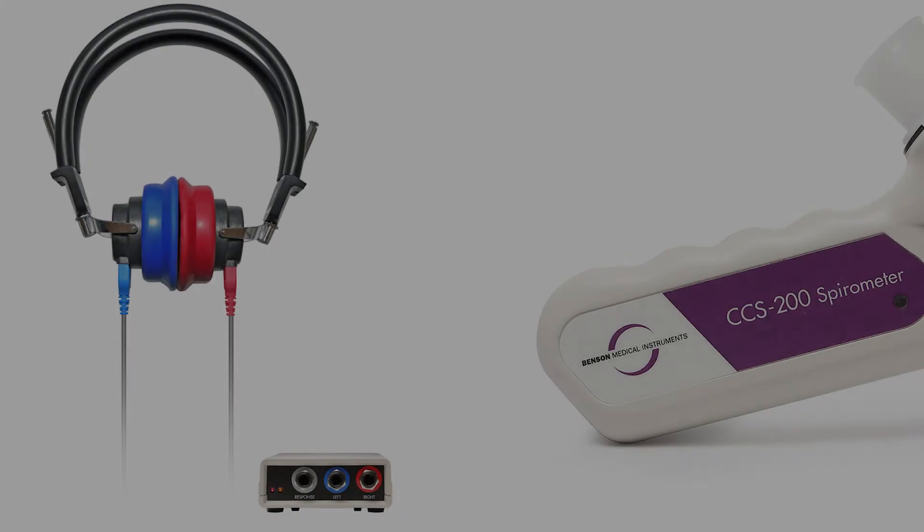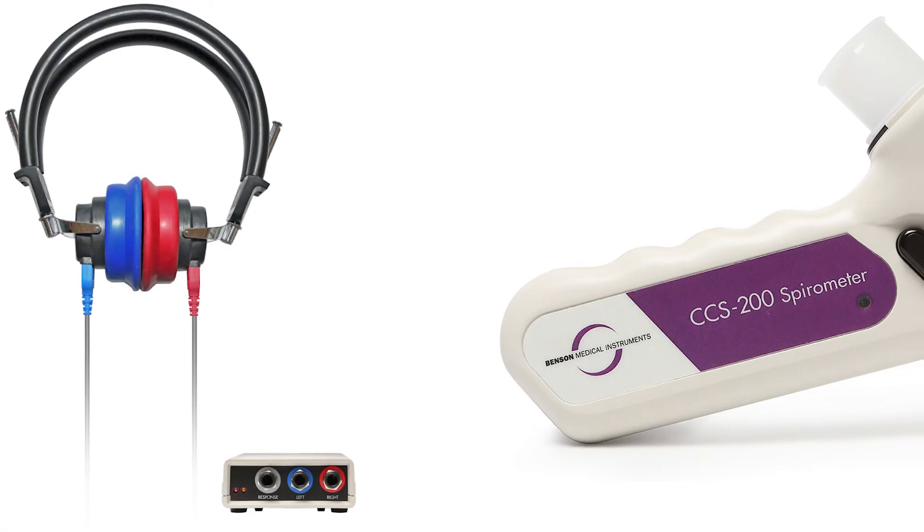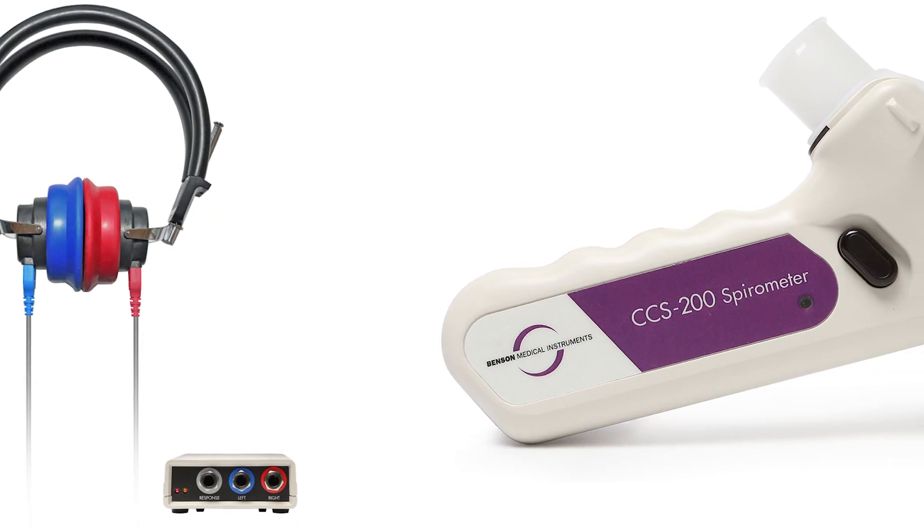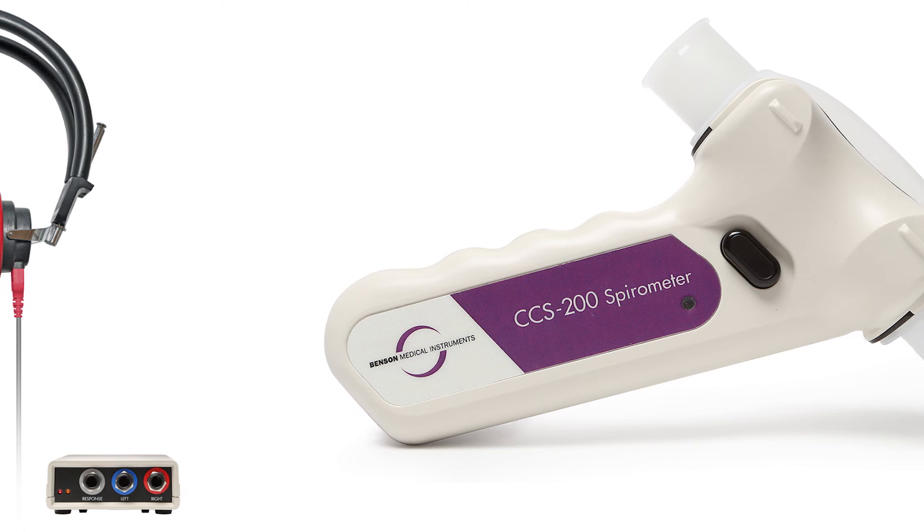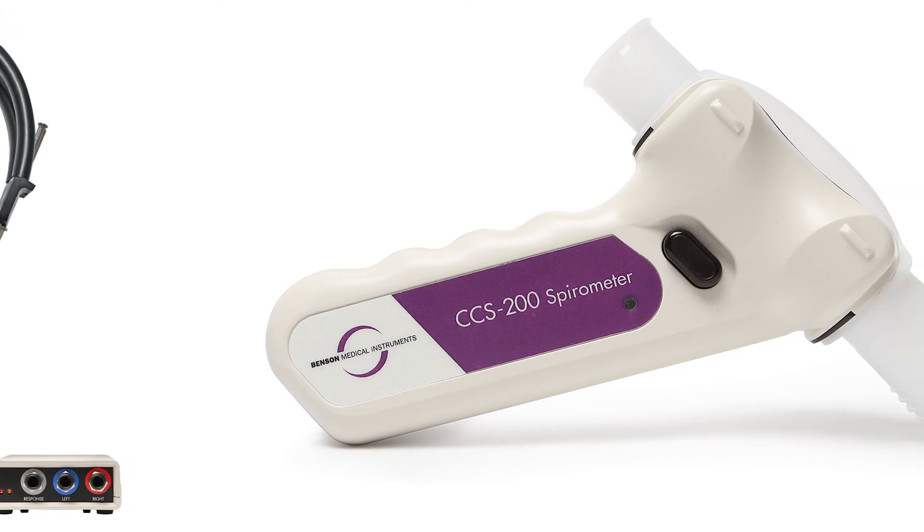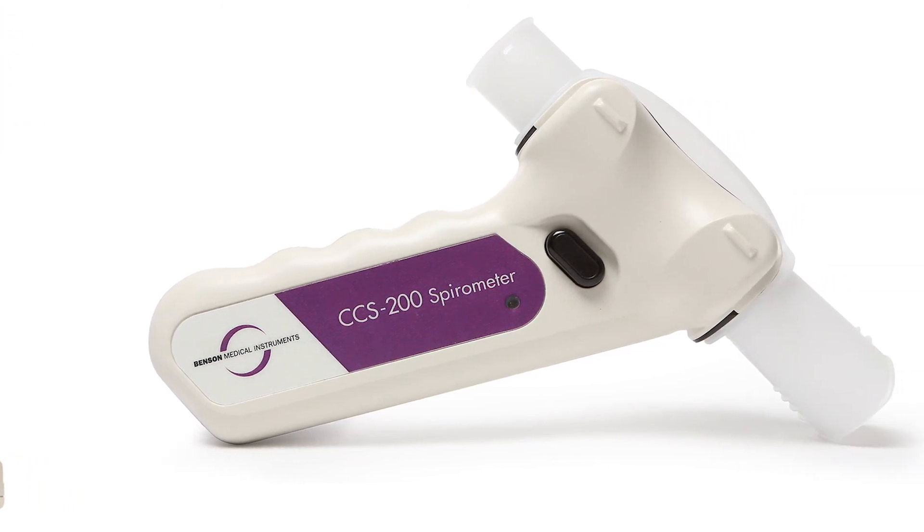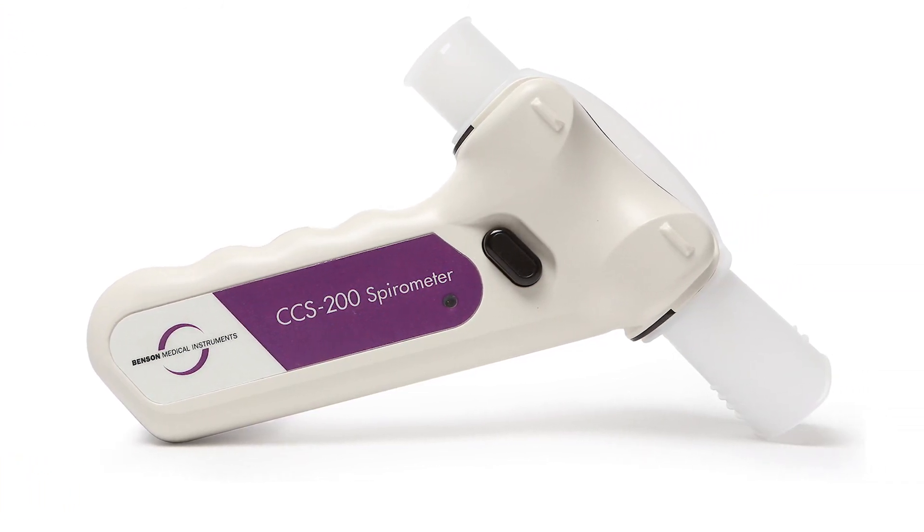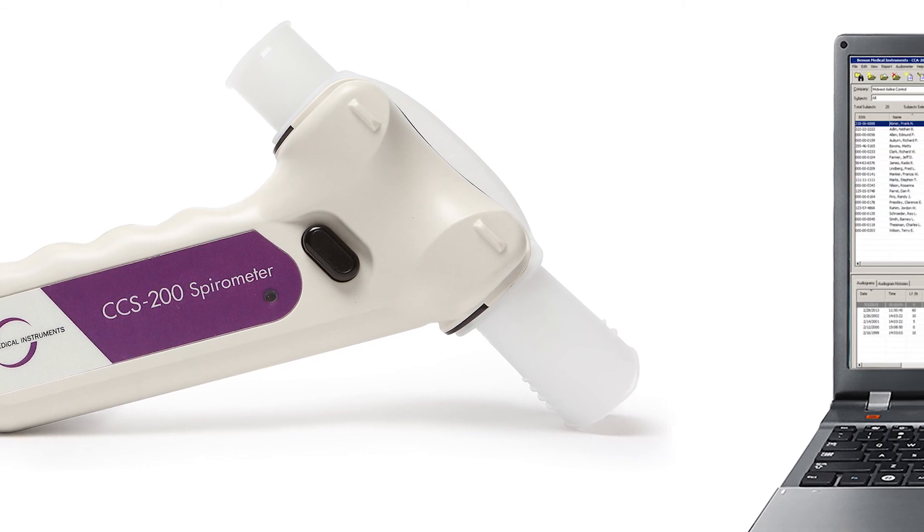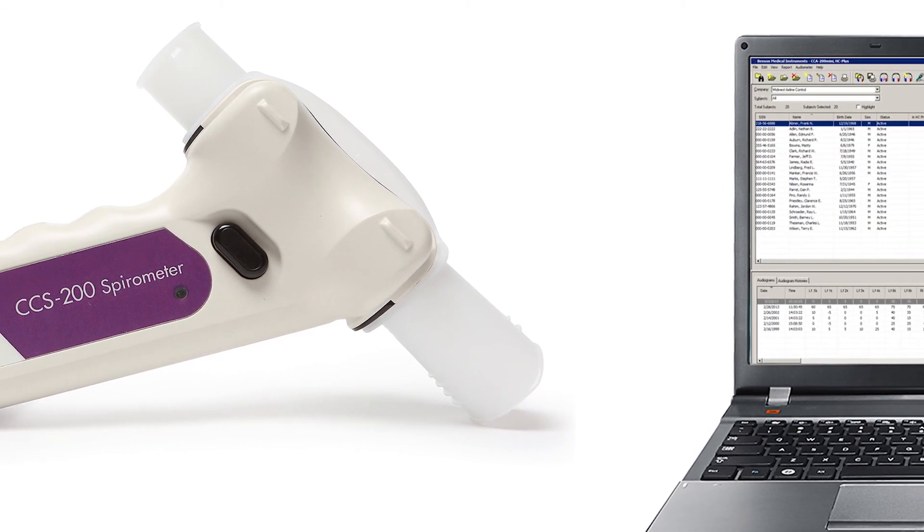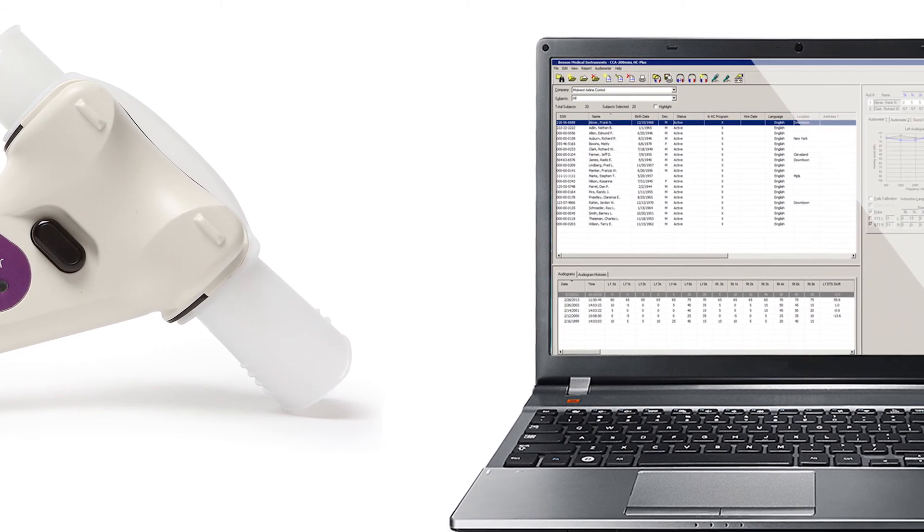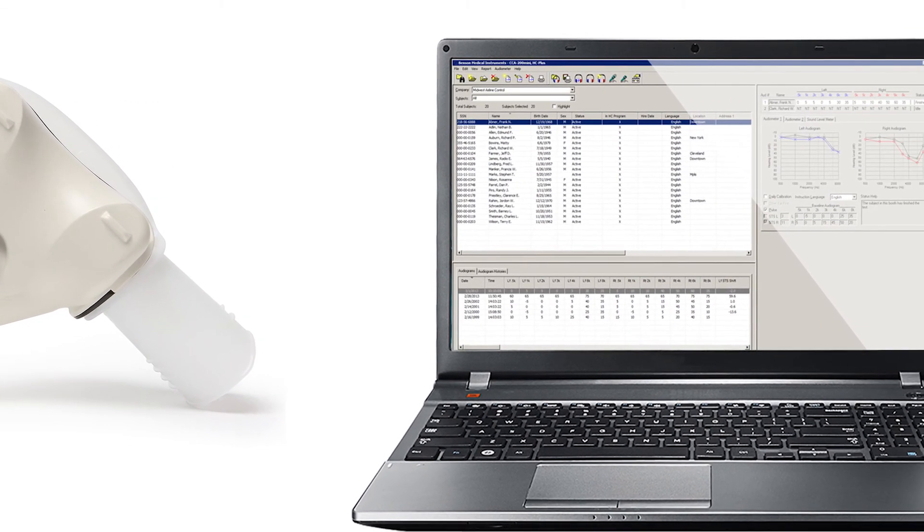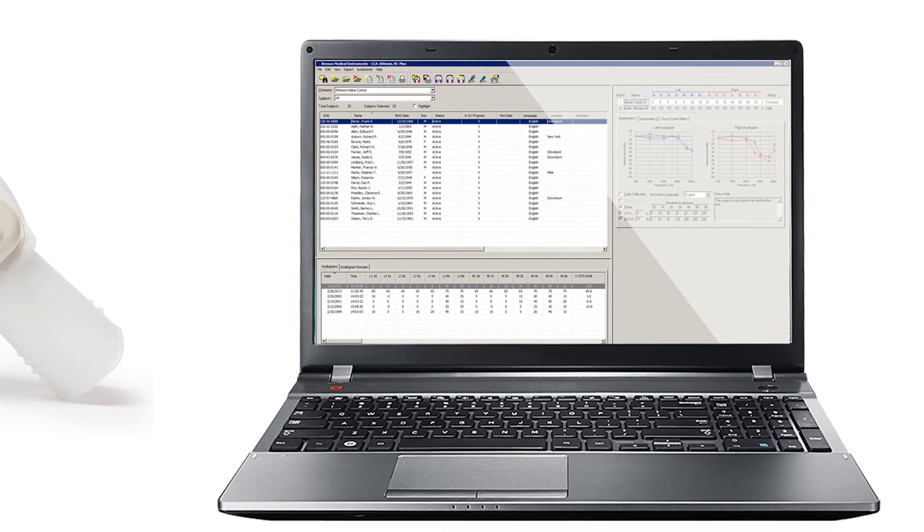In this video, we have seen how Benson Medical Instruments audiometers and spirometers can be operated separately and integrated to allow for compiling and sharing both audiograms and spirograms for individual subjects or company-wide monitoring and reporting.